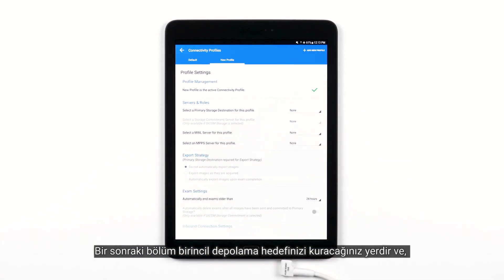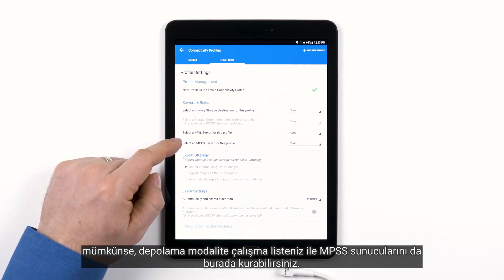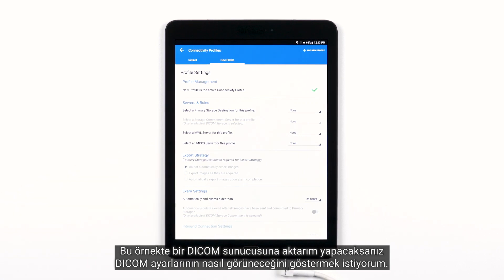The next section is where you'll set up the primary storage destination and, if applicable, your storage commitment, modality worklist, and MPPS servers. In this case, I want to show what the DICOM settings will look like if you are exporting to a DICOM server.